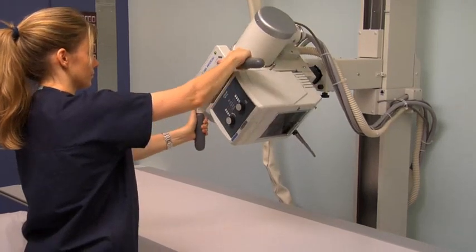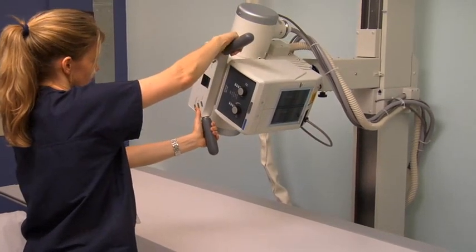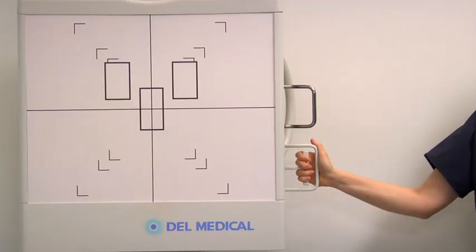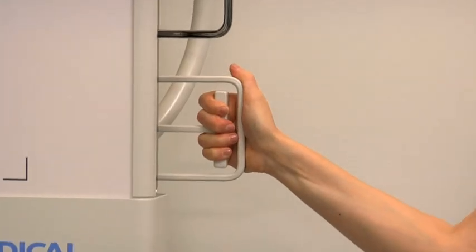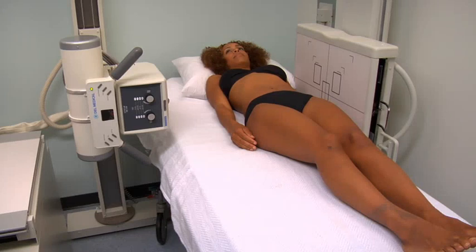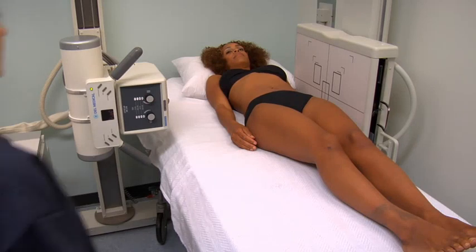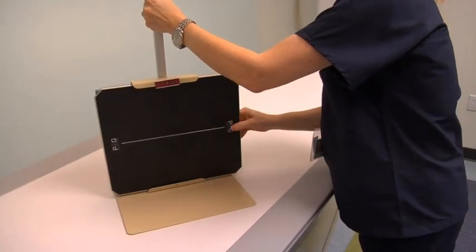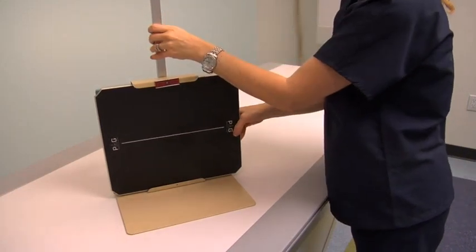Trauma patients require major adaptations of the standard projections. In particular, the angle of the central ray and placement of the image receptor must be adapted to accommodate a patient presenting on a stretcher. Most projections are obtained with the patient remaining in the supine position, which requires the use of a vertical Bucky or stationary grids for cross-table laterals.